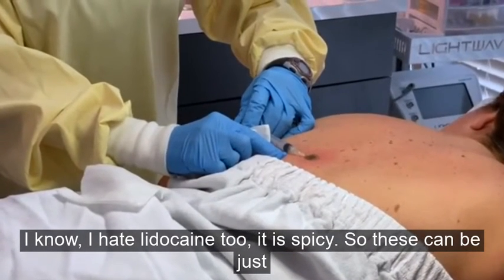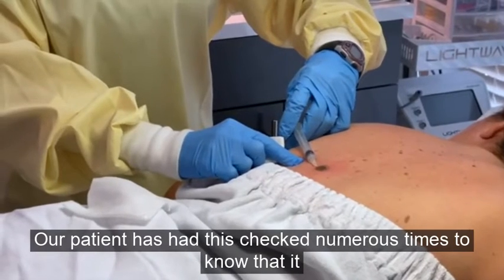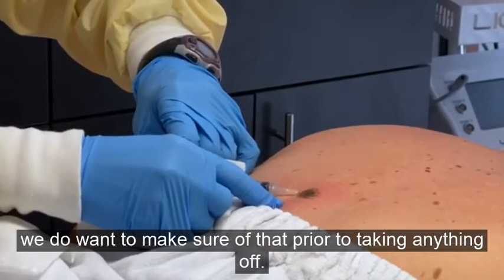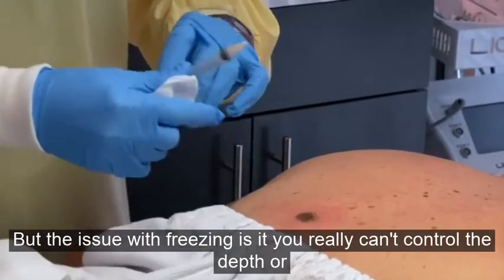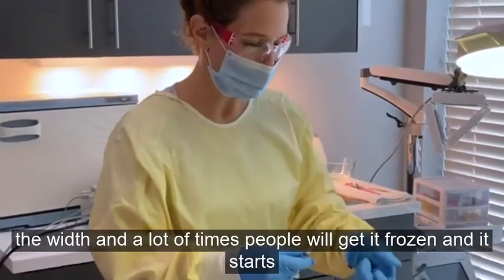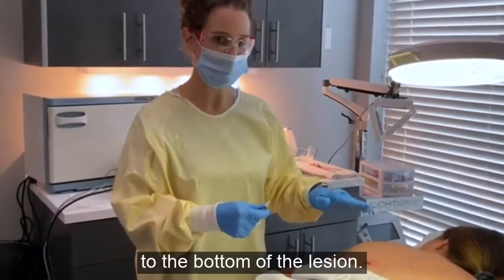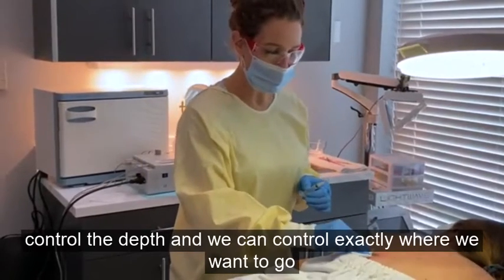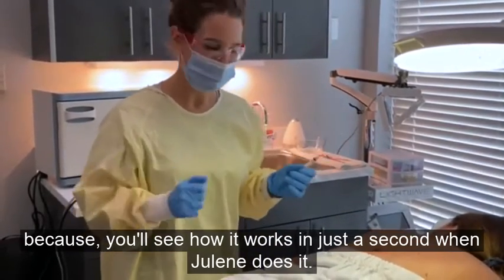These can be just unsightly, but they're very benign. Our patient has had this checked numerous times to confirm it's benign, and we do want to make sure of that prior to taking anything off. A lot of times people go to the dermatologist to have things like this frozen, but the issue with freezing is you really can't control the depth or the width. It often freezes normal skin around the lesion and doesn't reach the bottom. With electro desiccation, we're essentially burning the lesion off and we can control the depth and exactly where we want to go.